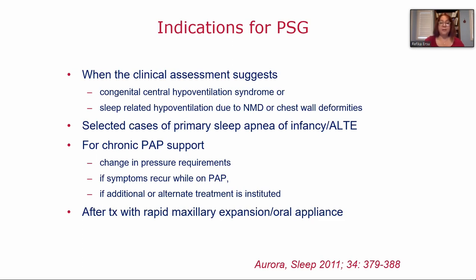And for chronic PAP support, especially if there's a change in pressure requirements, and also if there is additional or alternate treatment, to see if the patient still needs PAP. For example, you have a patient who is getting orthodontic treatment in addition to PAP, to see if maybe the patient doesn't need the PAP anymore. You can do a diagnostic portion.